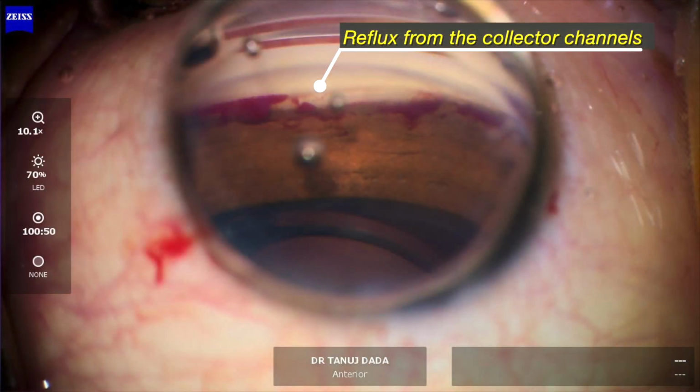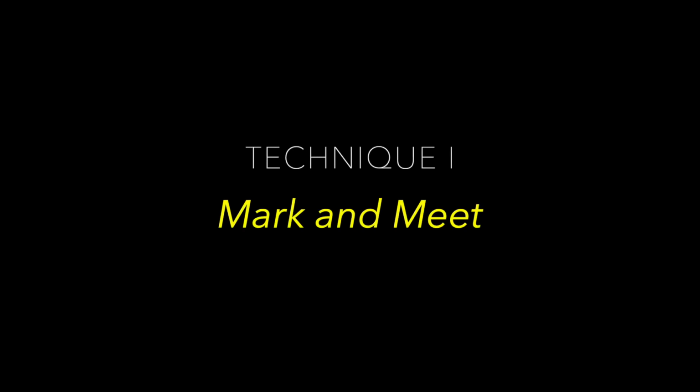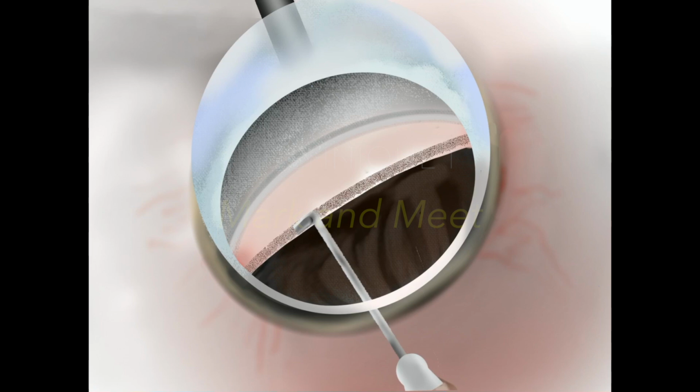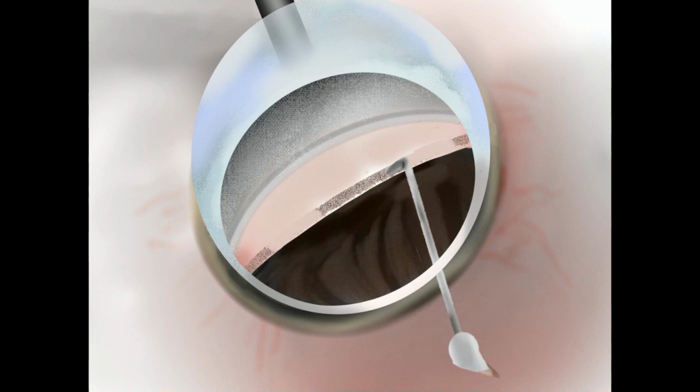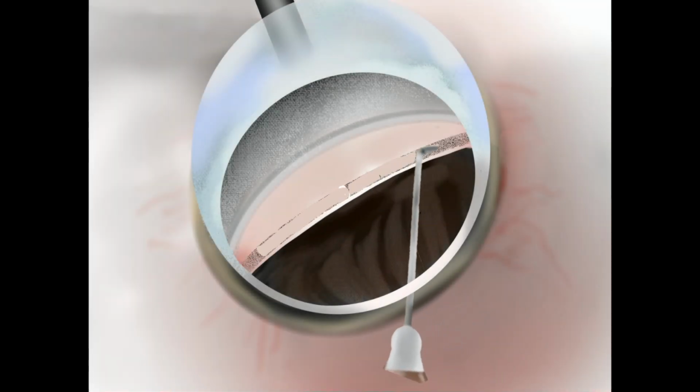The goniectomy may be performed using three different approaches. The first approach is mark and meet. The second one is the inside out approach. And the third is the outside in approach.